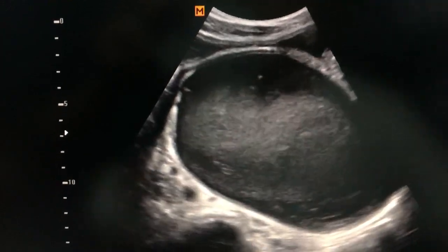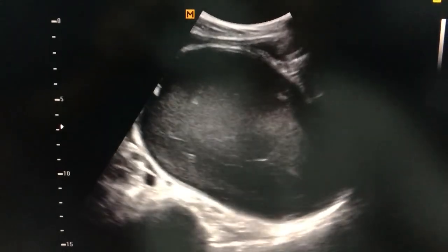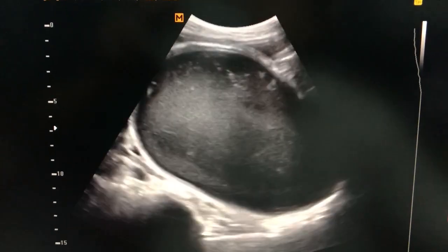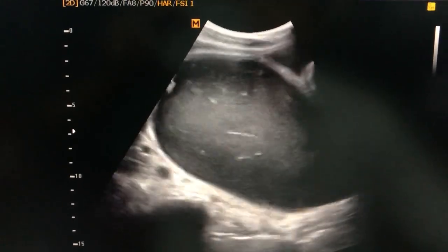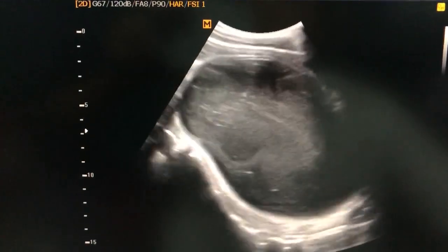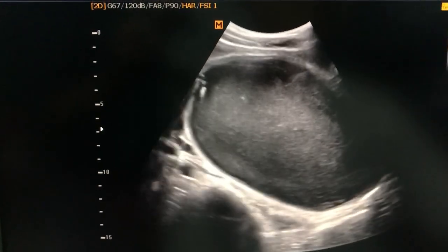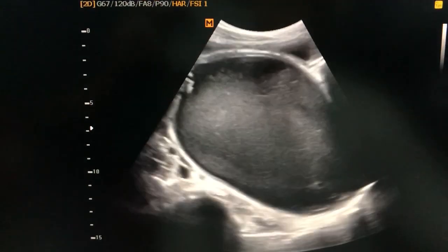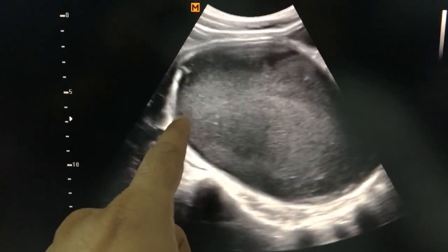You see this fluid is moving, it is a blood collection. It is a right ovarian simple cyst which has undergone hemorrhagic changes, internal hemorrhage inside the cyst. Might be due to venous stasis, and there is a cyst torsion also over here.